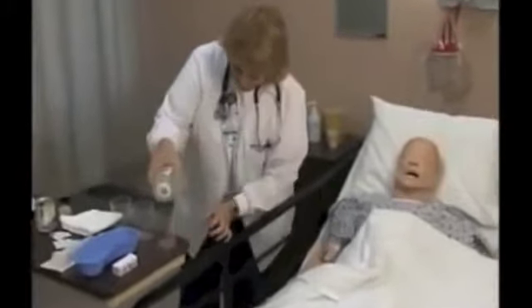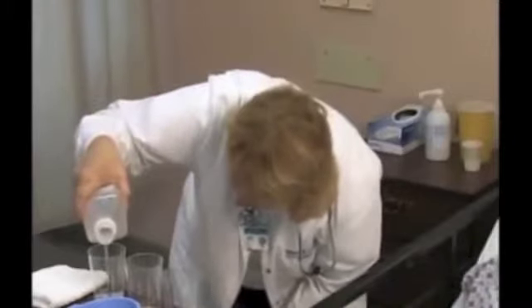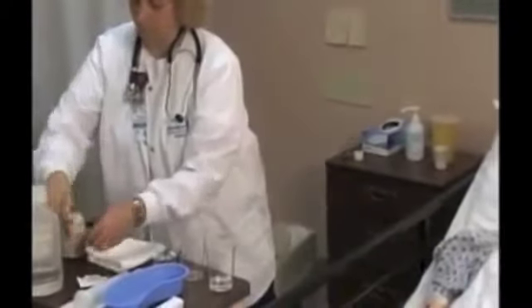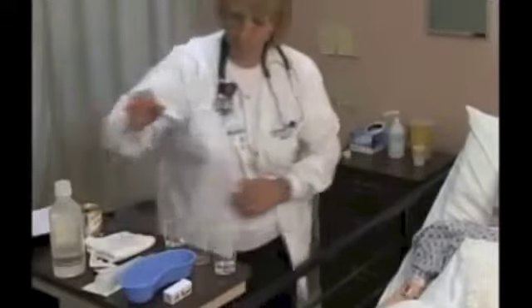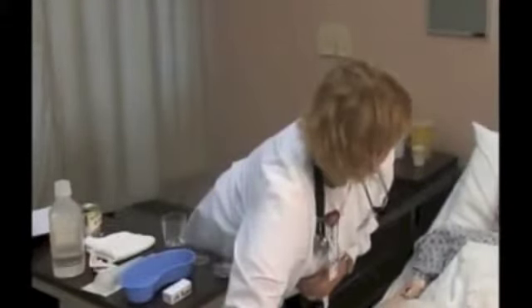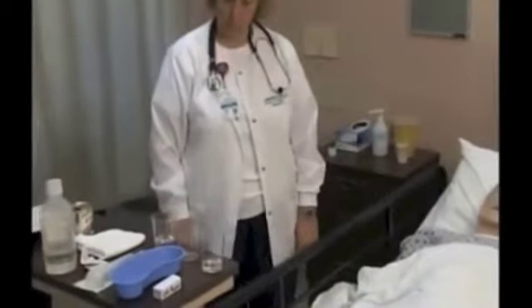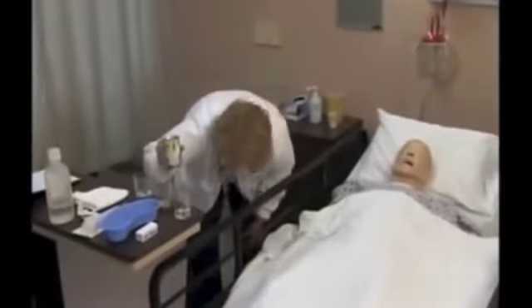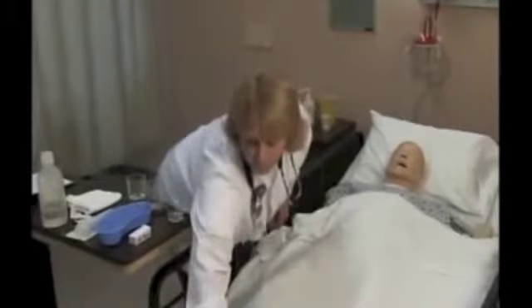Pour 30 milliliters of flush, tap water, 60 milliliters of flush, and make sure to get down at eye level to verify the amount when measuring. Measure the amount of ordered tube feeding in your middle cup. Put the head of the bed down to 30 degrees. Do not put a patient who is receiving a tube feeding flat in bed. And continue to pour desired amount of tube feeding. If necessary, raise the height of the bed to a comfortable working position.